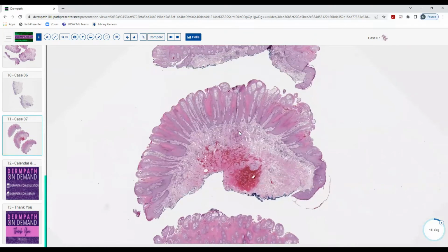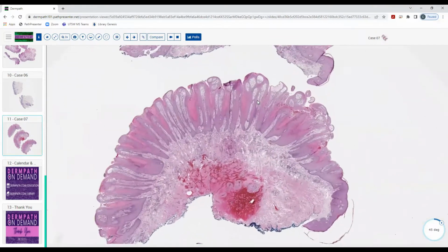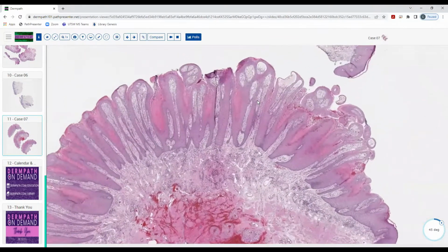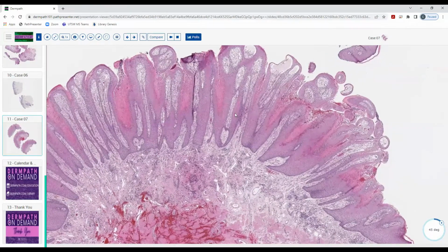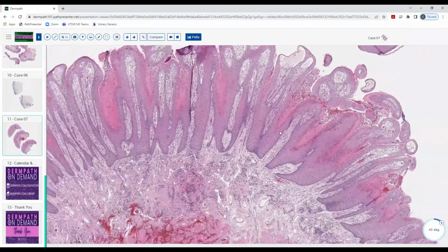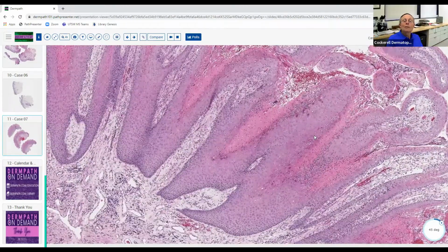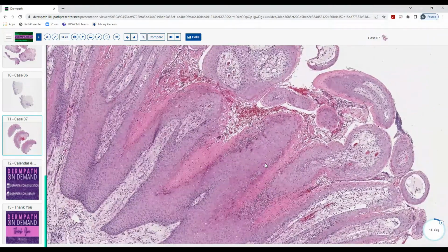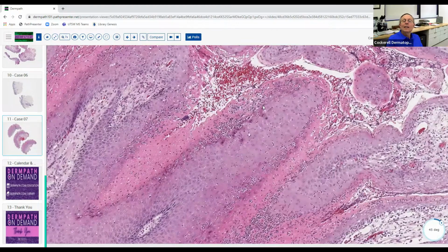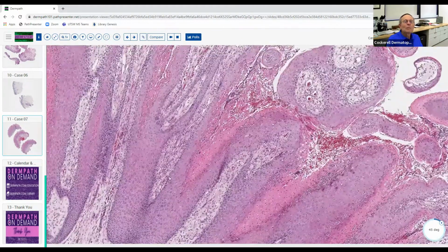Yeah, it's like a verrucous sort of appearing papule. Good. Pretty extensive acanthosis, hyperkeratosis. Let's see. And there's some hemorrhage in there as well. Does it look like a classic wart? No, not quite. Looks a little bit different, doesn't it? Doesn't really have any viral cytopathic effect. It's got a lot of neutrophils up here. It looks like it's super inflamed. It probably looked red and weeping and crusting.